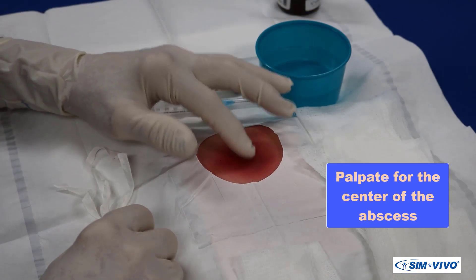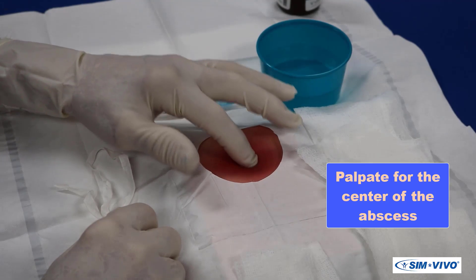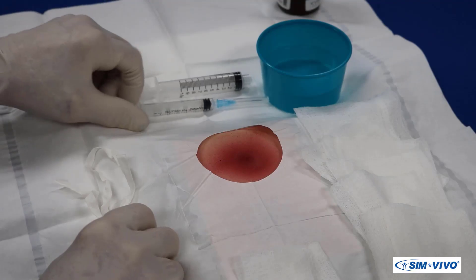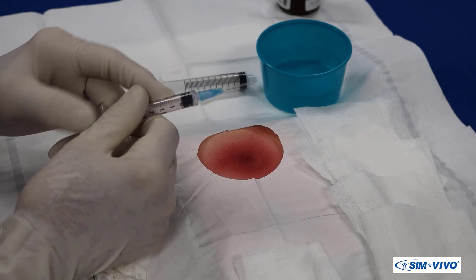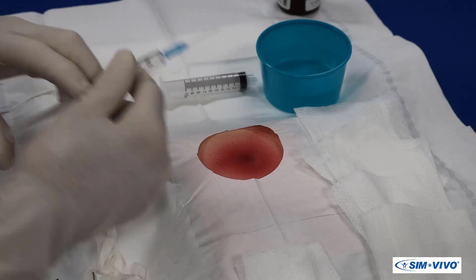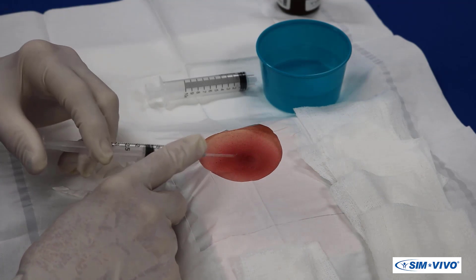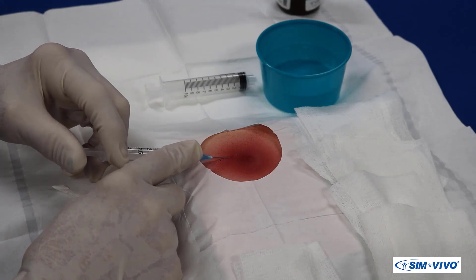You can palpate the abscess before starting. Usually there is a soft spot at the point where the abscess is migrating to the surface. The use of local anesthesia is a bit controversial since lidocaine is relatively ineffective in infections. However, some benefits may be derived from a field block around the proposed incision. For this exercise, we will fill the syringe with air as a substitute for lidocaine.